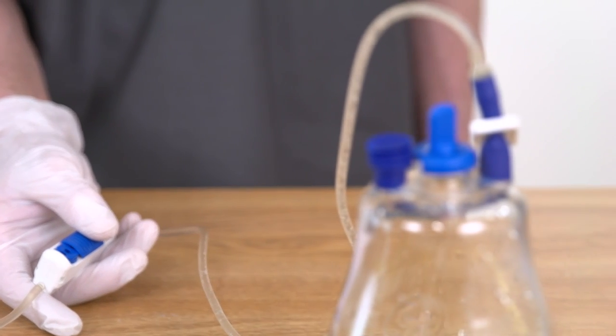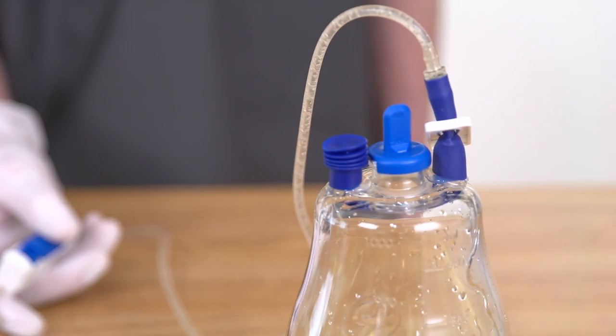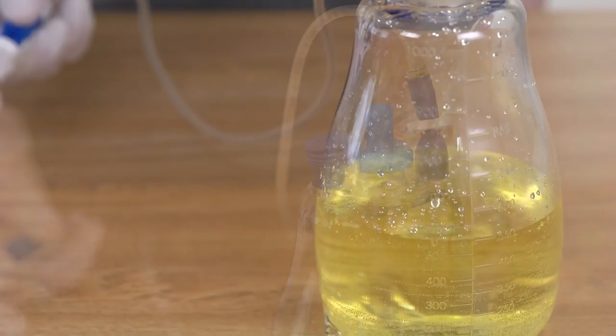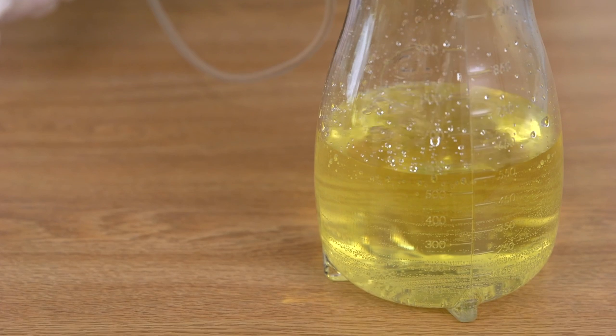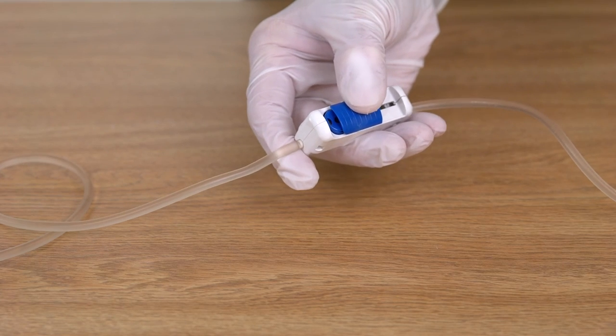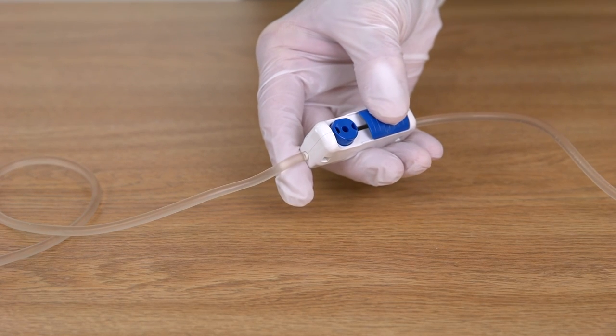Drainage typically takes 5 to 15 minutes. Slowing flow rate will signal that drainage is nearly complete. Once drainage has stopped or the bottle is full, release the button on the flow control valve to stop the vacuum.